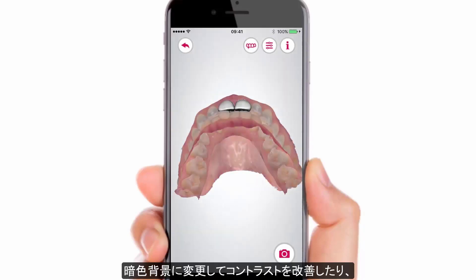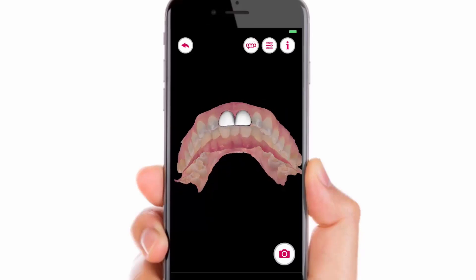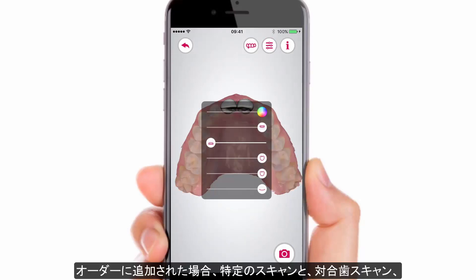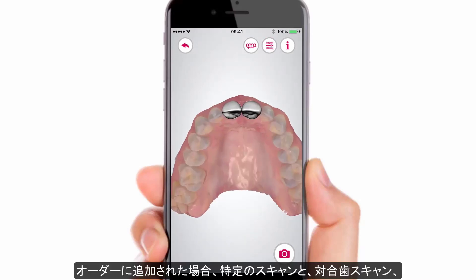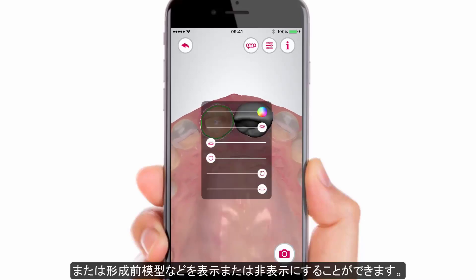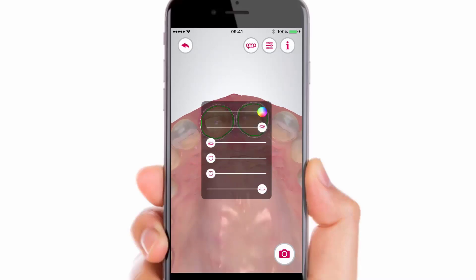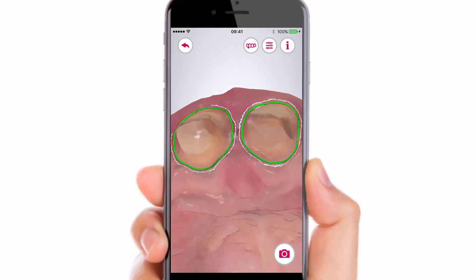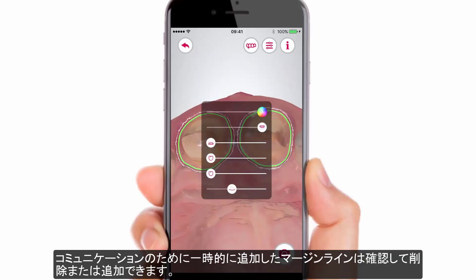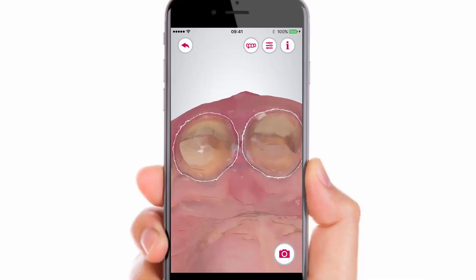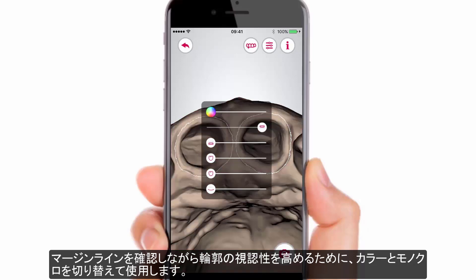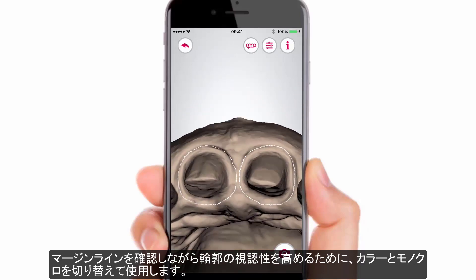You can change the background to black for better contrast, or use sliders to change the visibility of the scans. Enable and disable visibility of certain scans and features like antagonist scan, design, or pre-preparation if added to the case. Remove or add margin lines while examining the case, and change from colour to monochrome for better contour visibility while examining the margin line.